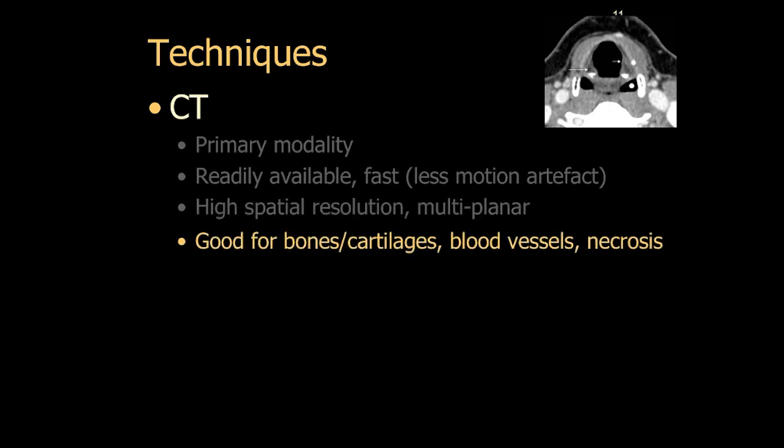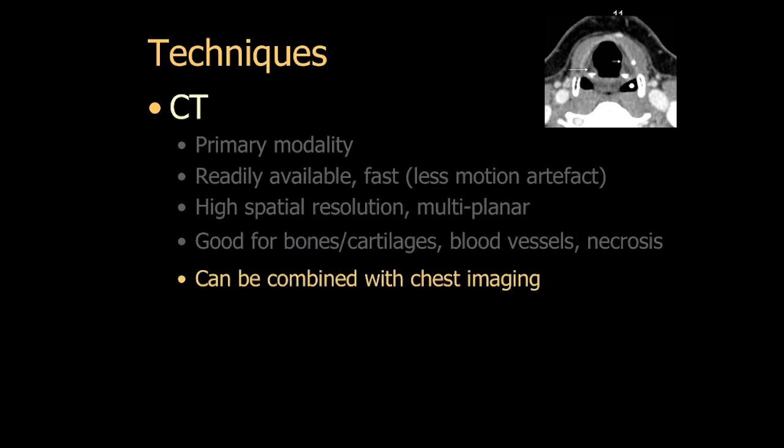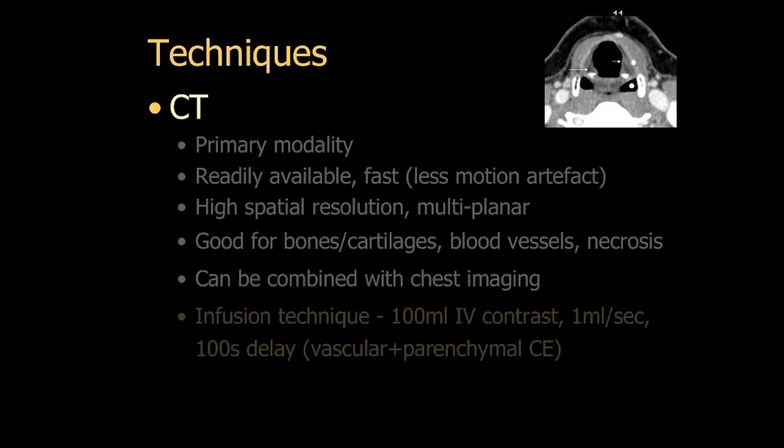CT is also excellent at depicting bones, cartilages, blood vessels, and to look for areas of necrosis, particularly within lymph nodes. Another big advantage of CT is that it can be combined with chest imaging, especially when you're dealing with cancer.